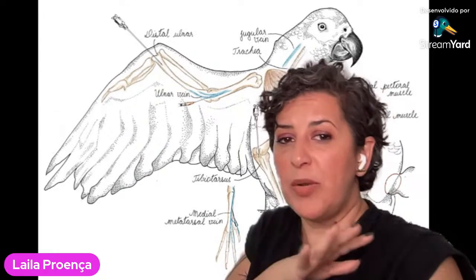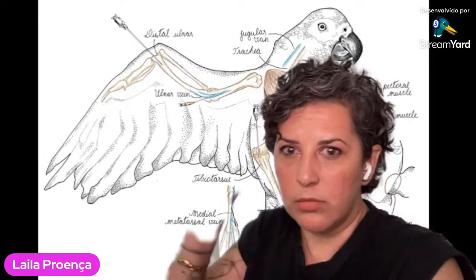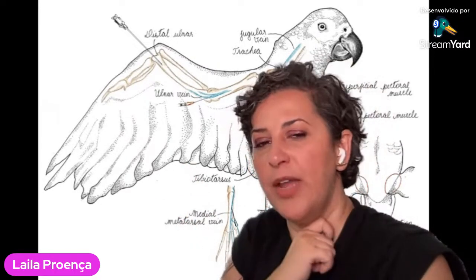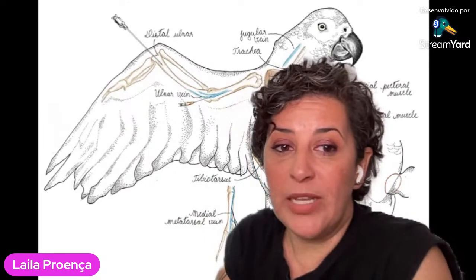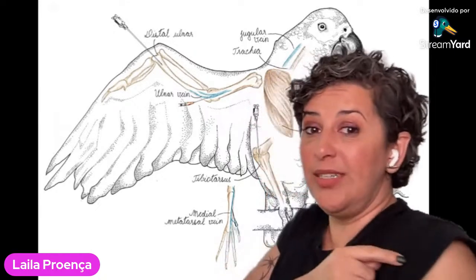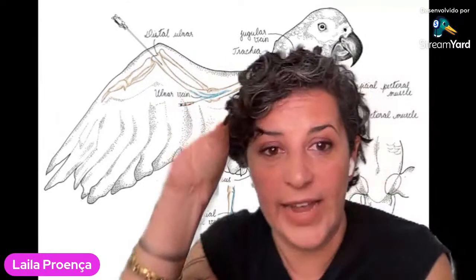For here, the neck, none of the places you need to pluck feathers, you can just put a little bit of alcohol. Don't wash the bird with alcohol. But then you can see the veins. I also love the medial metatarsal vein. I love it for catheters. See this vein right here for IV catheters is the bomb. I love it. And then from the ulnar vein, that's the video I'm going to show you guys now.